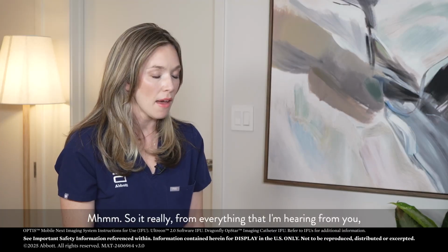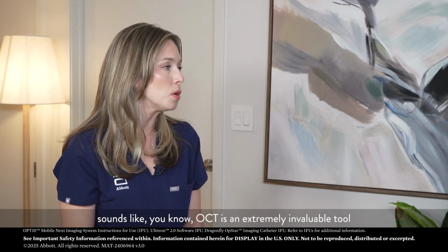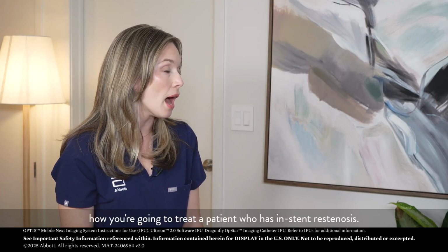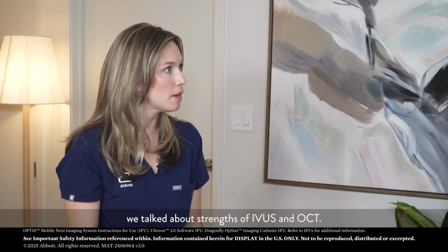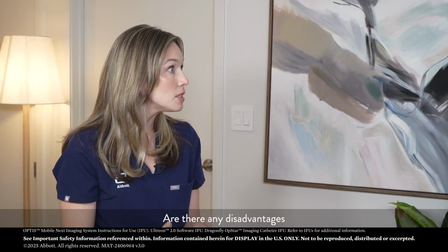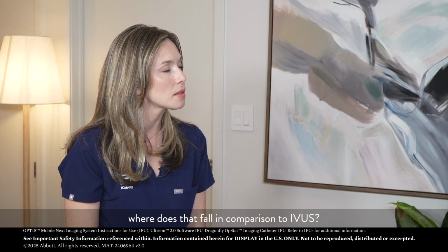So from everything that I'm hearing from you, it sounds like OCT is an extremely invaluable tool when it comes to determining how you're going to treat a patient who has in-stent restenosis. Going back to some of the earlier videos, we talked about strengths of IVUS and OCT. Are there any disadvantages to using OCT in ISR, or where does that fall in comparison to IVUS?